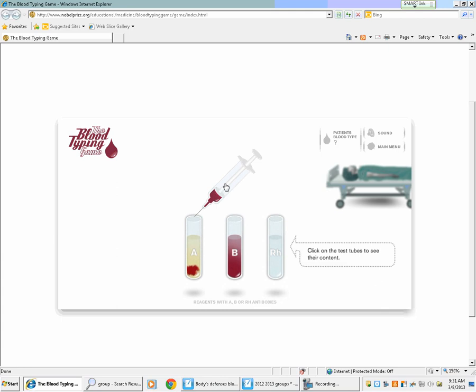Okay, so you're saying what about that patient's blood? How do you know that's type B? Okay, so you're probably assuming that it is A, because there are what? What was in there? A antibodies, and those antibodies did what? They attacked it, right? Which caused it to clump. Very good, doctors in training.